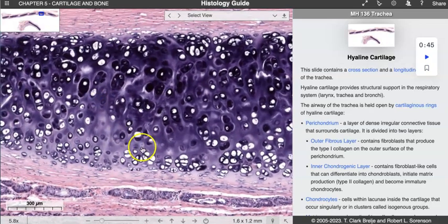When we look at elastic cartilage, they're really, really tightly clustered together. And there's matrix, but there's not as much matrix as we see here. So this is kind of the even distribution of cells. We have a kind of a medium amount of cartilage matrix. And then when we go to, let's say, fibrocartilage, lots of matrix, really dense matrix. And the cartilage cells, the chondrocytes, kind of are these what we call isogenous clusters of cells. They kind of island together, and so they're not as spread out as we see here.